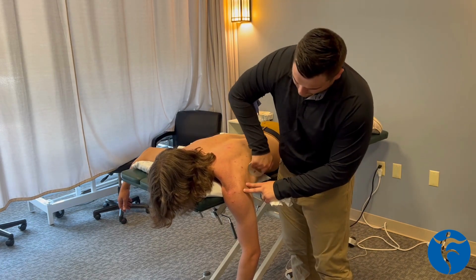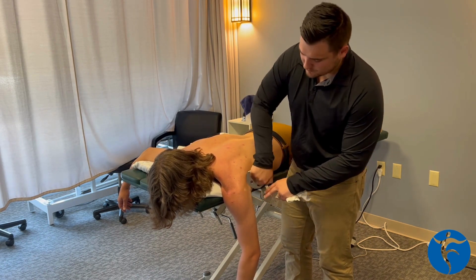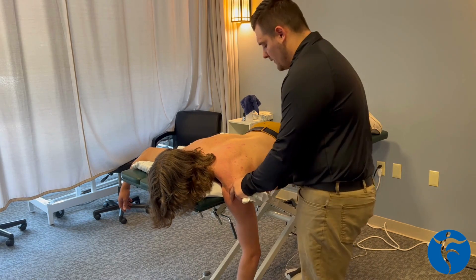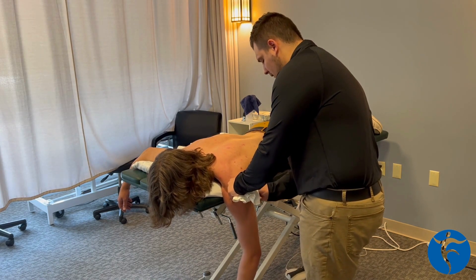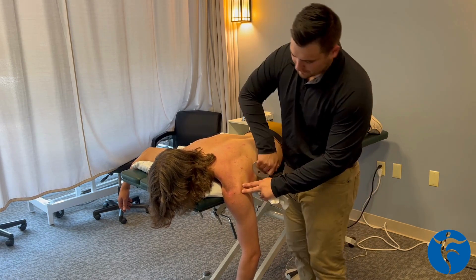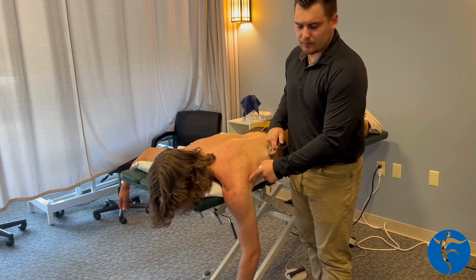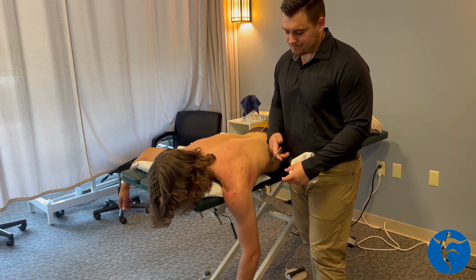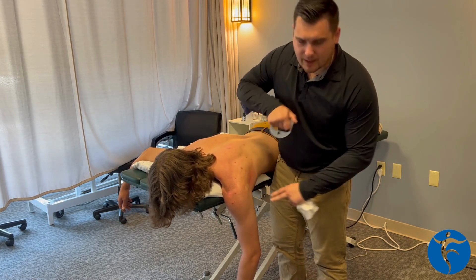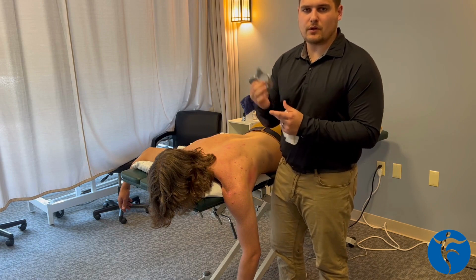From here, we're just going to start working this lat out a little bit. I change which way I'm going depending on where I find those adhesions, which for Andrew right here, you can feel them. Working down this way feels pretty smooth, but once I flip and go back up, you can feel them getting bound up. So that just tells me that's where the adhesions are. You'll see some redness, which comes with being tight. We're not trying to bruise anybody — just give smooth pressure, lifting and pushing at about a 45-degree angle. You can switch the orientation of the instrument.